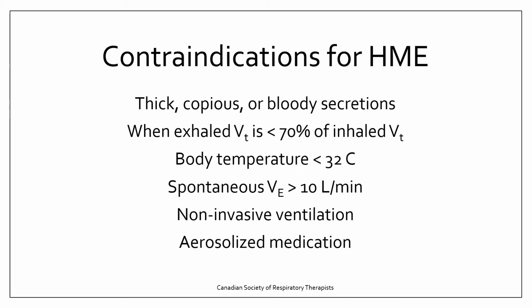Minute ventilation is that large. If a patient's on non-invasive ventilation, we'll use active humidity. And then if we have to give some sort of aerosolized medication into the system through the ventilator circuit, then it's going to get trapped in the HME. So it's not really appropriate for this patient, and we would have to use active humidity for that patient.